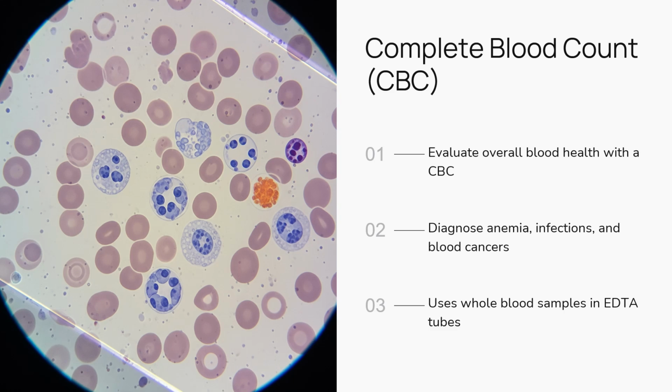The complete blood count, or CBC, is a fundamental test used to evaluate overall blood health by analyzing different components of the blood. It is essential for diagnosing conditions such as anemia, infections, and blood cancers by providing detailed information on red blood cells, white blood cells, and platelets. The test uses whole blood samples collected in EDTA tubes, which prevent clotting and preserve cellular elements for accurate analysis.